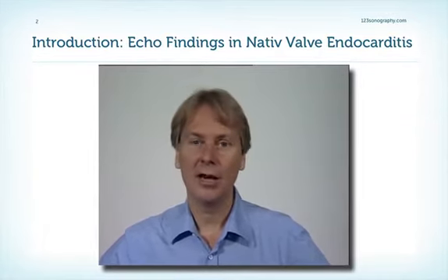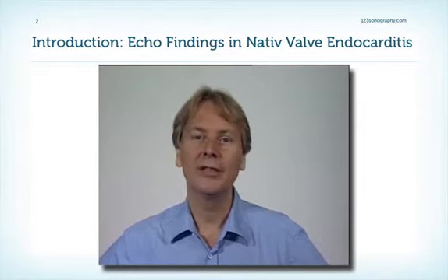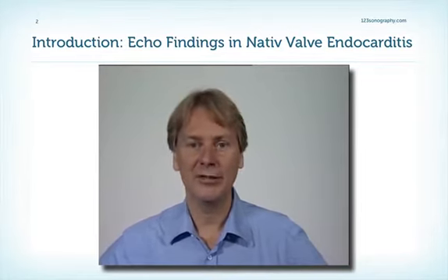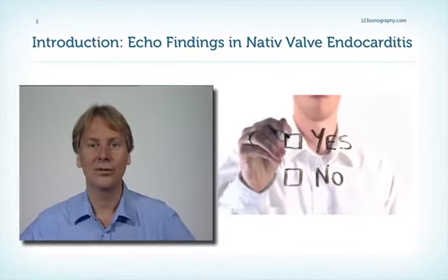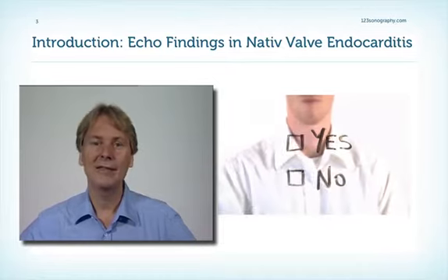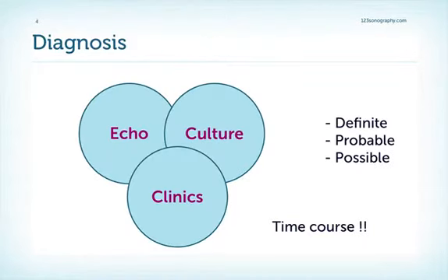Well, many in our hospital have recognized this and have realized that if we put endocarditis on the referral, then they would usually have a fast lane ticket to an echo. So what I usually do when I get these patients into our lab, before doing the echo, I look at them and I try to guess, do they really have endocarditis? Yes or no? And surprisingly, very often I'm right. Nevertheless, echocardiography is the foremost way to diagnose it and not the clinical picture. But you need both. Nevertheless, the clinical picture is very important.